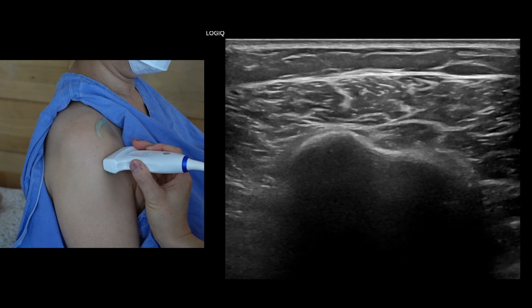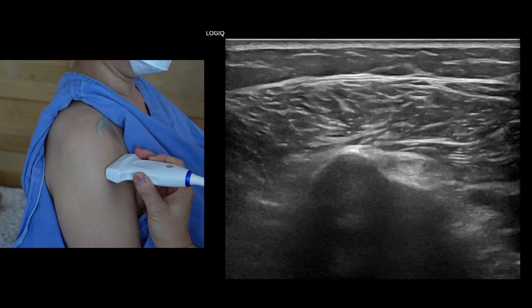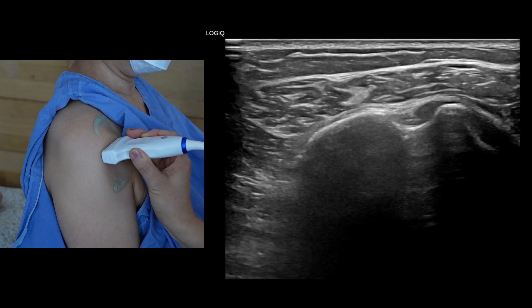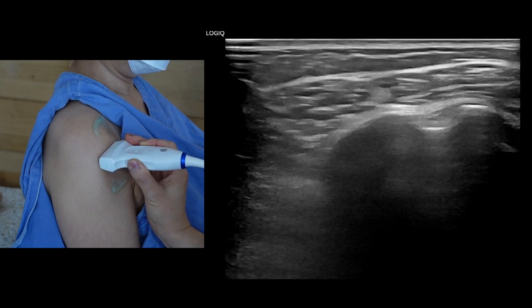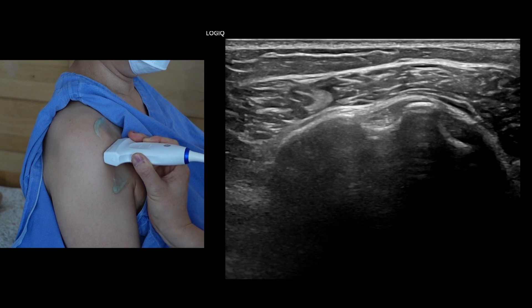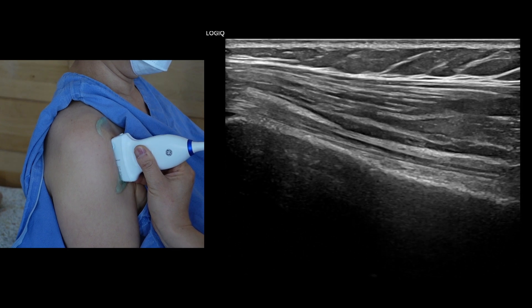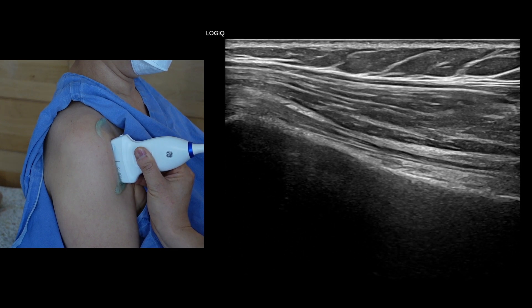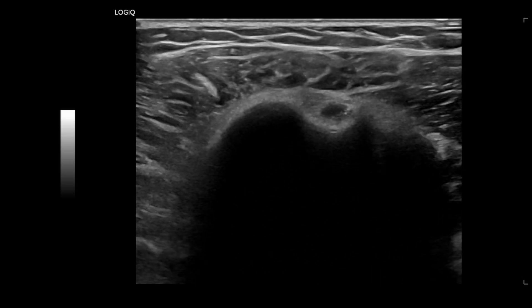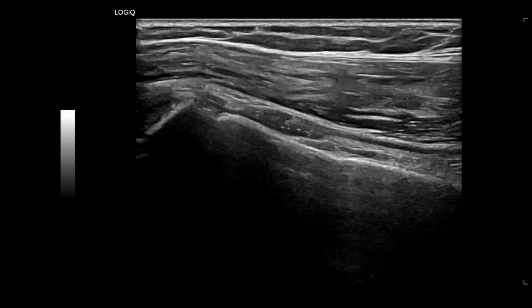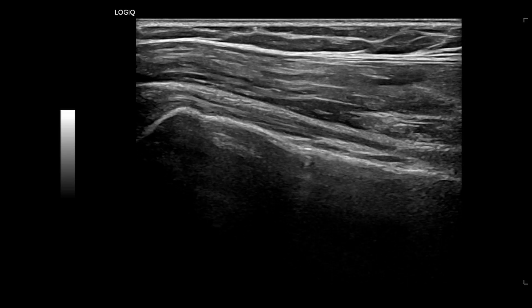For the initial scan, focus on the long head of the biceps tendon. The optimal position for examining the biceps tendon involves having the forearm supinated and resting on the thigh, or with a slightly externally rotated arm. Begin by locating the long head of the biceps tendon situated between the greater and lesser tuberosities, using both transverse and longitudinal planes for a thorough examination. During the scan, assess the size of the biceps tendon and its fibrillar pattern, and look for any peritendinous fluid that may indicate pathology.